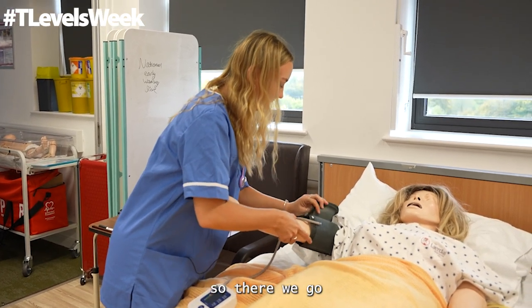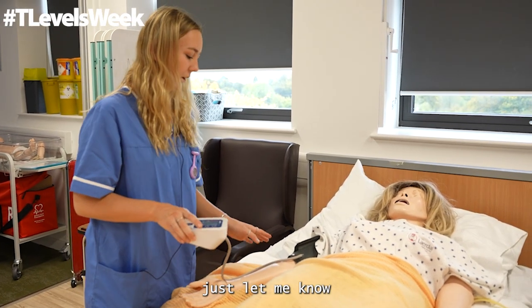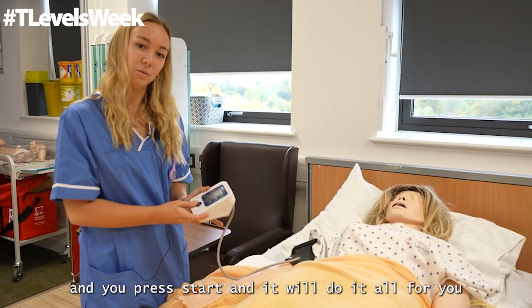So there we go. So Susan, it's just going to get tighter, but if you want me to stop at any time, just let me know. And you press start and it will do it all for you.